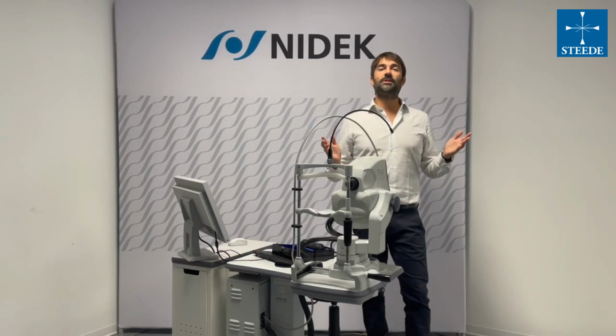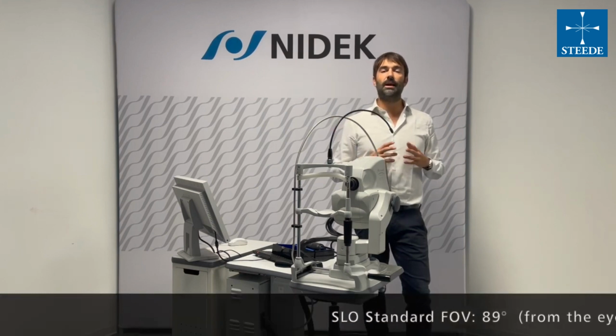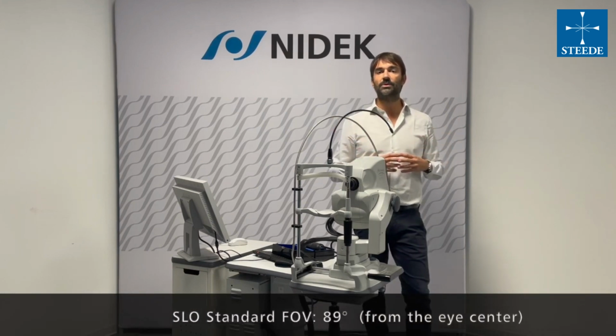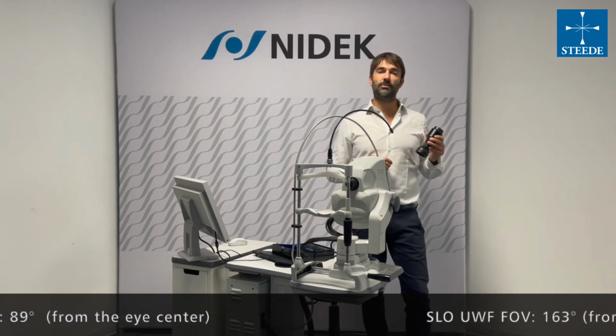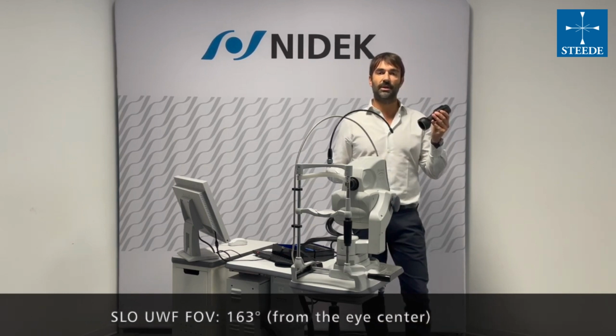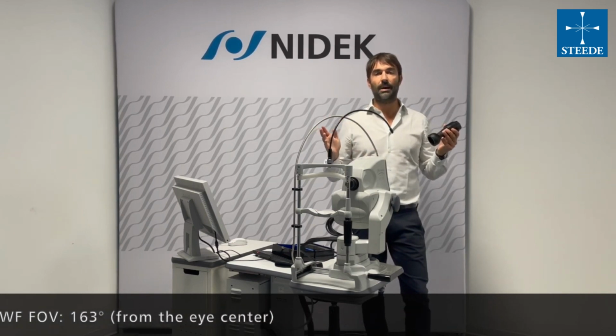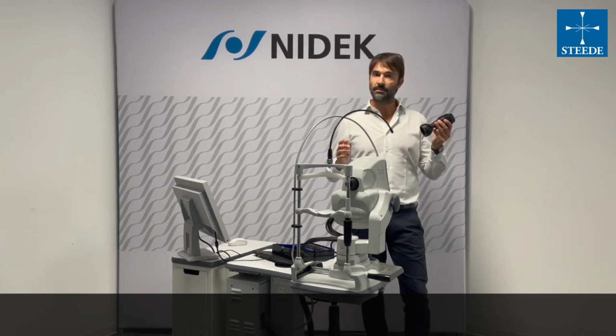So the images we've seen so far were taken in standard field, which corresponds to 89 degrees in diagonal for SLO-based images and up to 16.5 millimeters for OCT scans. But remember that in FA, ICG, retromode imaging, and color imaging, thanks to this extra attachable ultra-wide field lens, we can expand the field of view up to 163 degrees. Let me show you how it works.